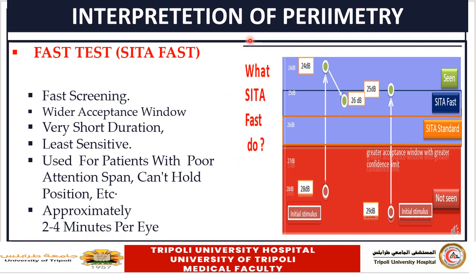That's why it is very fast and is used mainly for patients who cannot withstand sitting for a long time and have poor attention. Now we will go into details and see what SITA fast does.